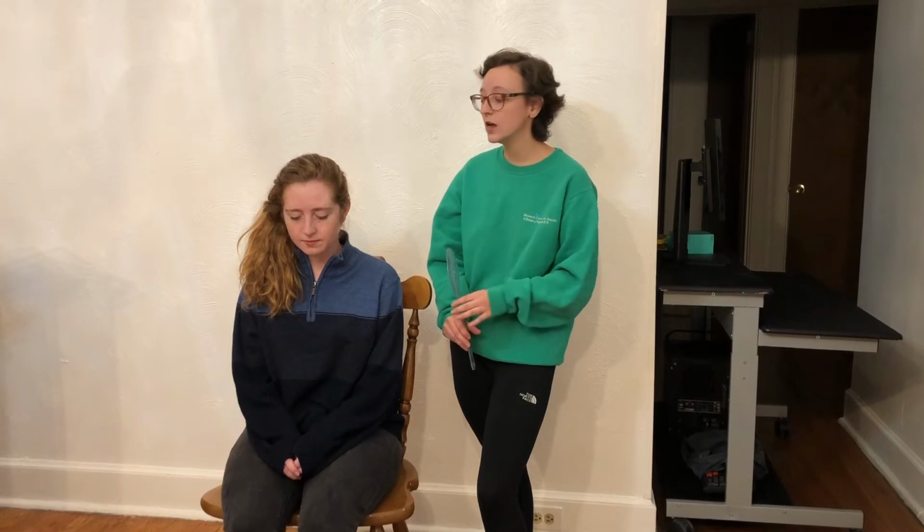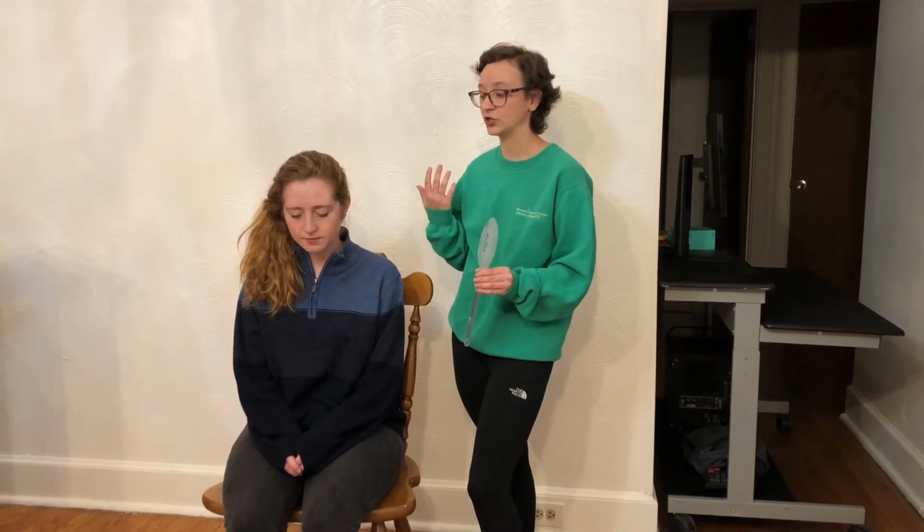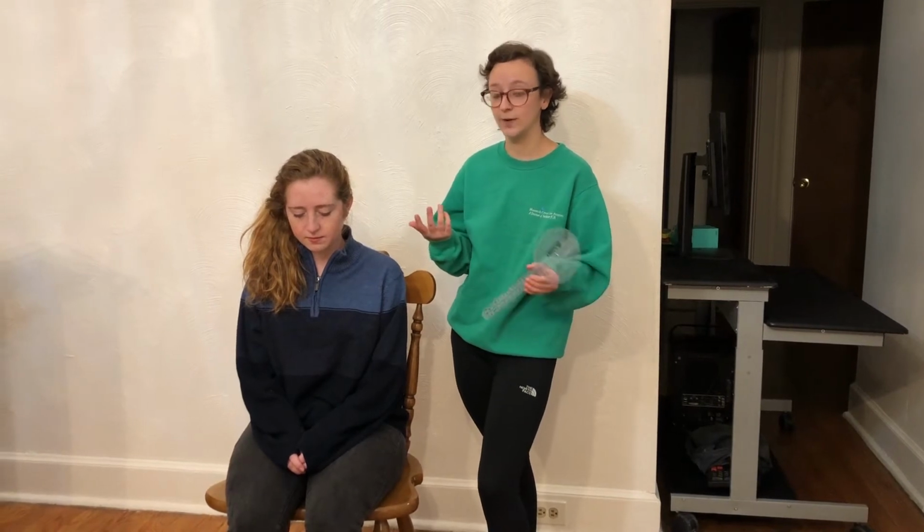So I'm going to be measuring my patient's active range of motion, and I would measure passive range of motion if my client wasn't able to get full range of motion actively. But for this I'm just going to measure active range of motion, and if she's not able to get there, then I will do passive. So first I'm going to start with the neck.